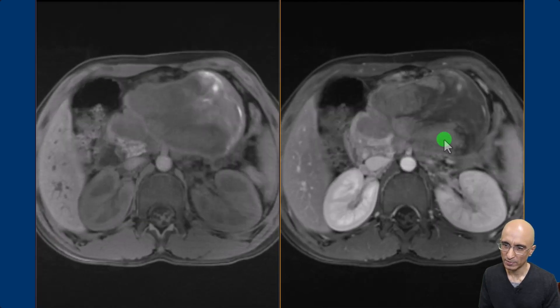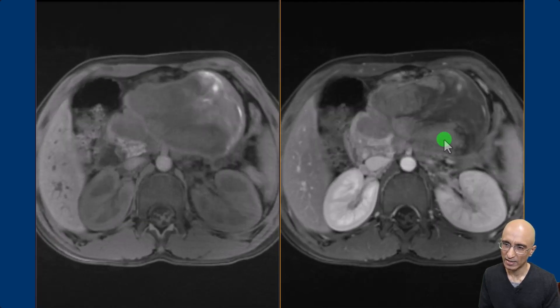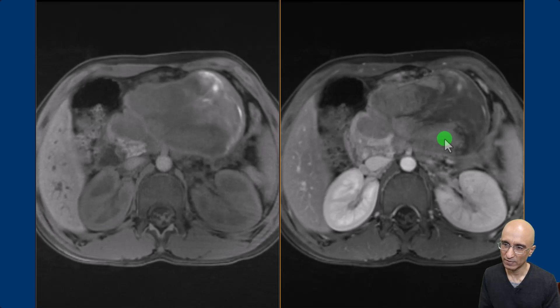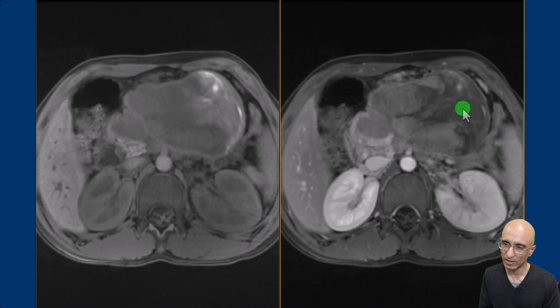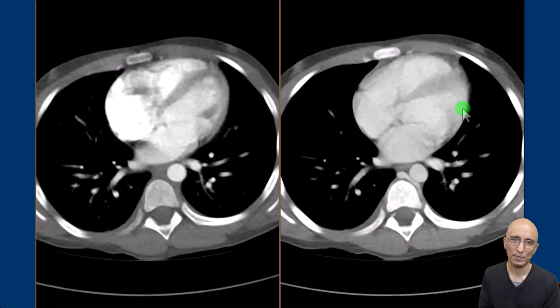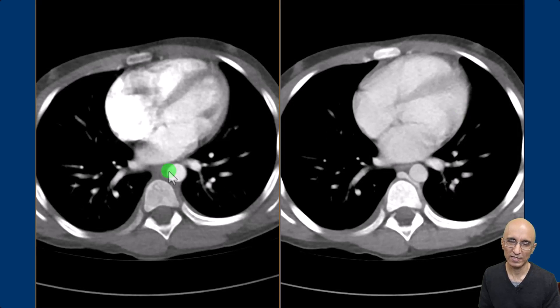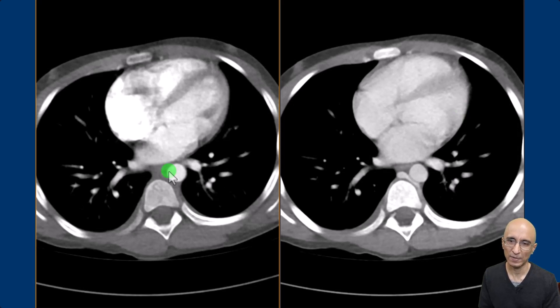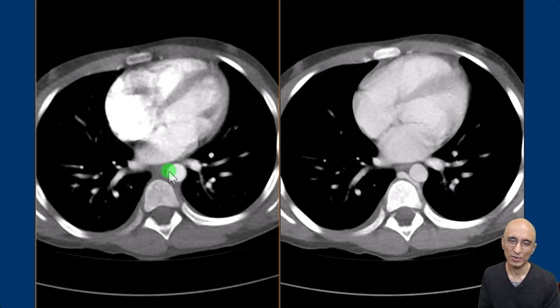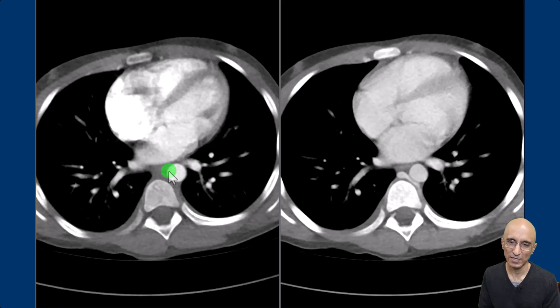On the post-contrast images we can see slight enhancement of the solid component of the lesion. We can also see the necrotic foci. As part of pre-surgical planning we also performed CT angiogram and CT venogram to delineate the vascular anatomy.